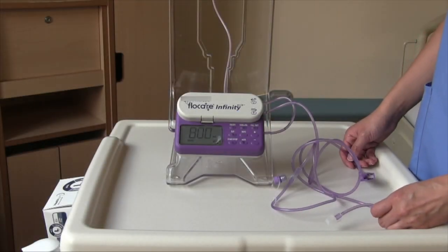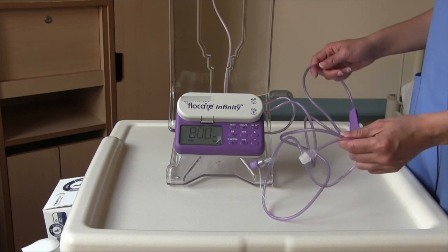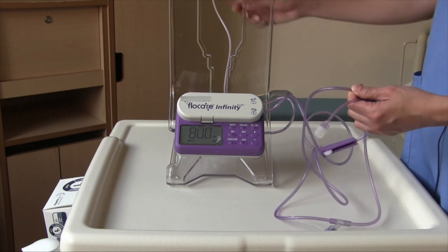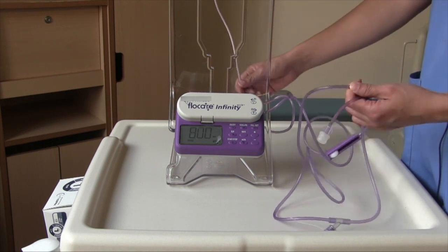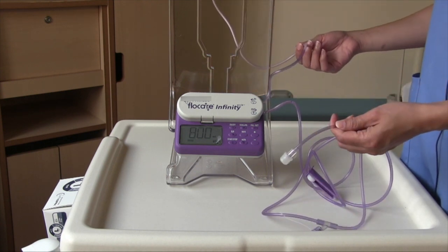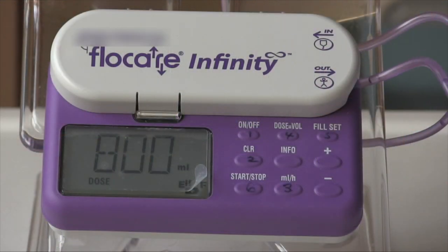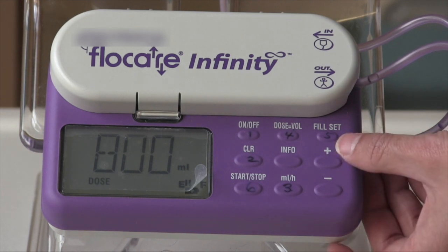After you've set the dose, you will want to do what we call priming the line, which is pushing the air out of the line while having the feed come through. You don't want to be putting this amount of air into your stomach as it may be uncomfortable. To prime the line or push the air out, we'll now go to the fill set button.